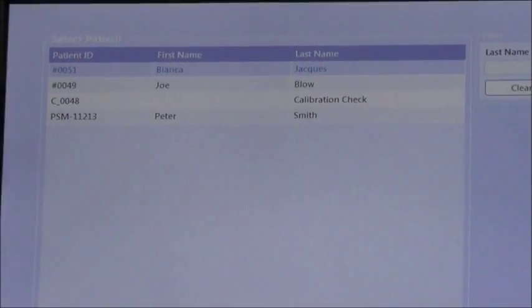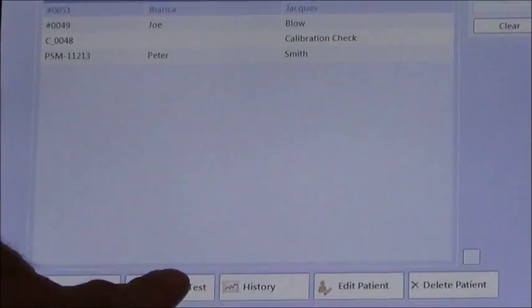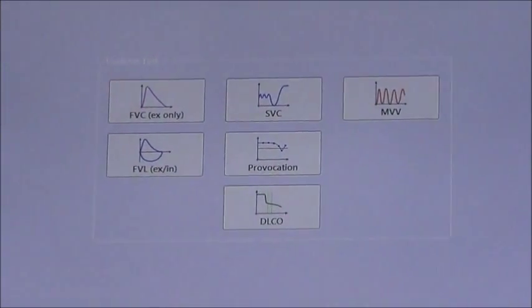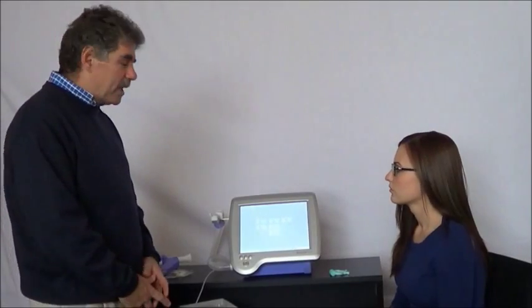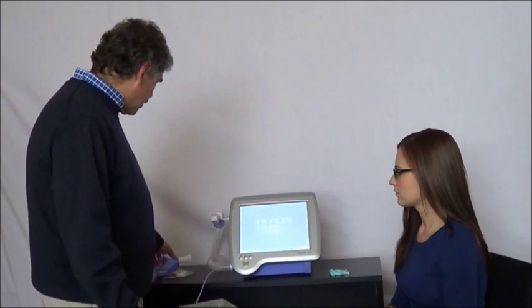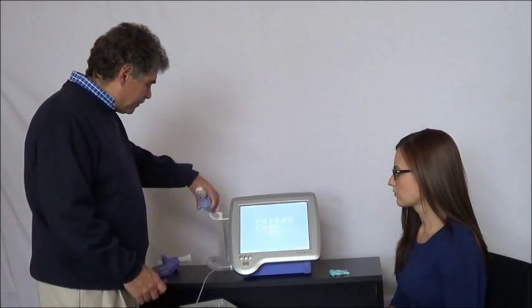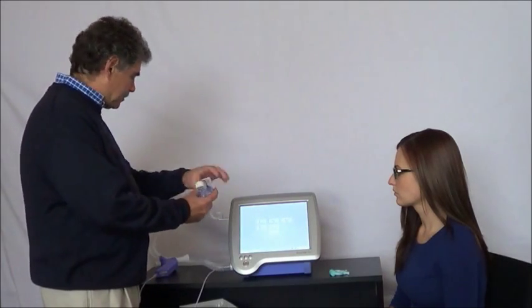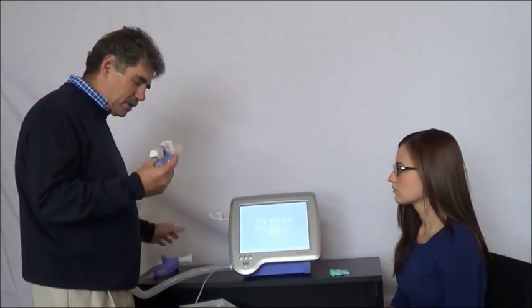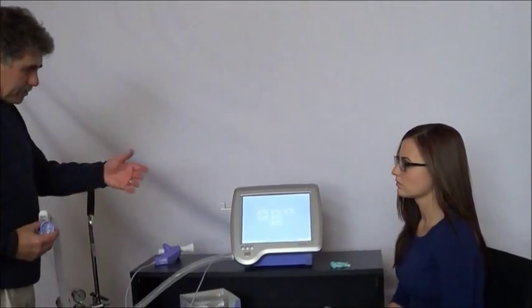From here, we're ready to perform the test. I hit 'Perform Test' and up comes the test menu. Now we're ready to do the DLCO maneuver. That involves connecting up the DLCO valve — we've got this device all connected, and we have gas already connected, gassed up and ready to go.